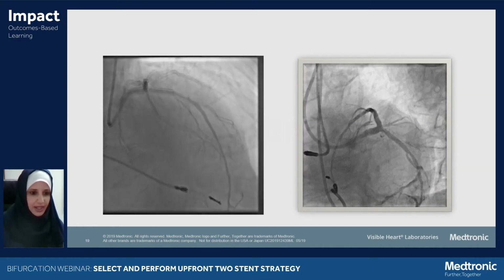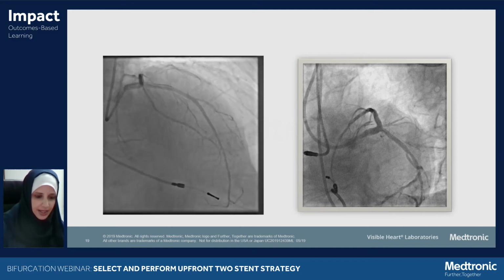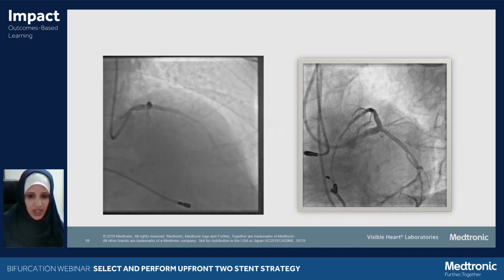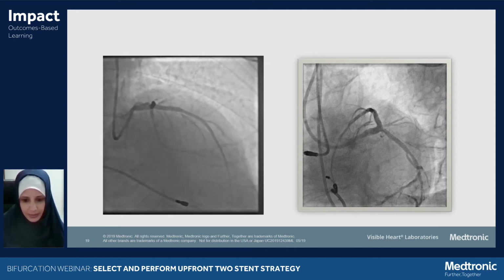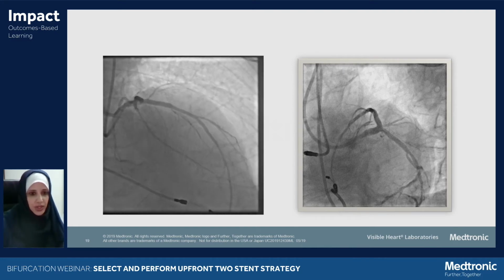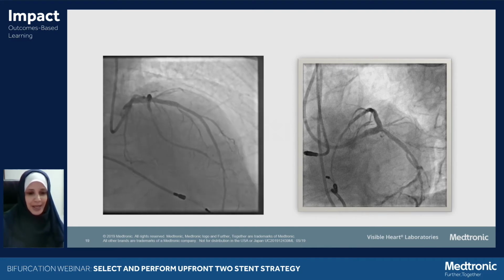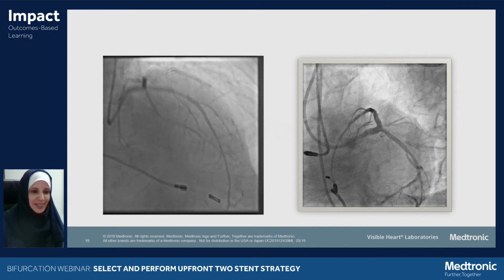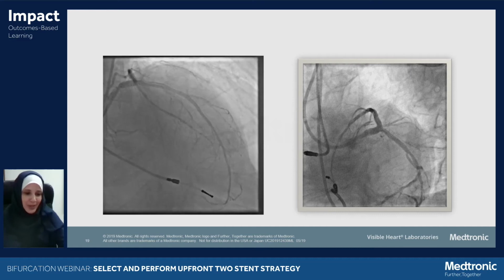What you end up having is the LAD after we had stented it, and in the final image on the right hand, you see all the vessels are actually preserved. Unfortunately, I did not do a post-procedure OCT, which ideally we should have done, but an 88-year-old man was starting to get cranky after all this time, and we just had to move on, to be honest.